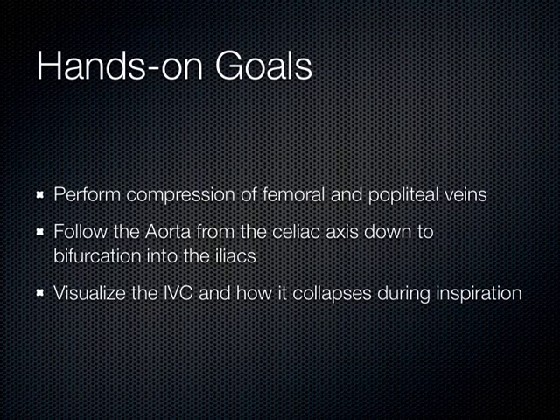Okay, so today, with the hands-on session, we're going to do compression of the femoral vein and the popliteal vein. You'll see how fast this goes today. It's going to be a pretty quick scanning session, I think, because you're just compressing the fem area, and then you go down to the pop, and then you're going to follow the aorta down until it bifurcates, and then I want you to look at the IVC and how it collapses during inspiration. That's about it. If you have time left in your group, by all means, scan whatever you want today. Use it as a free scanning session to tighten up wherever else you have questions, heart, whatever it is you want to do. But really today, it's the DVT, aorta, and IVC.